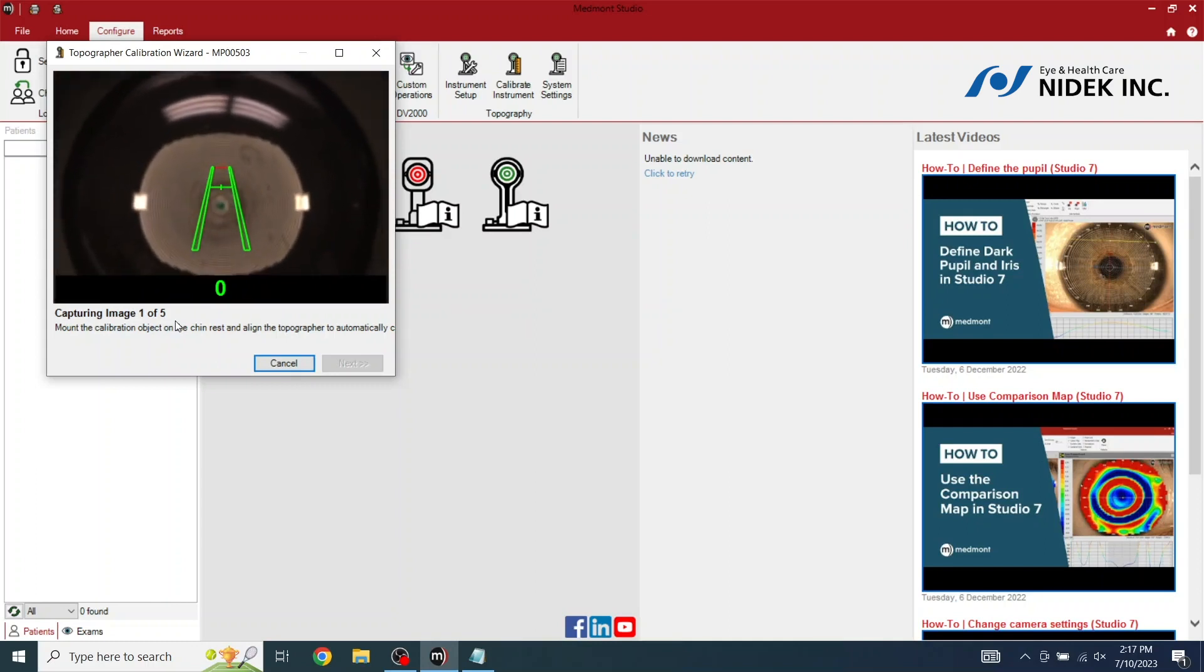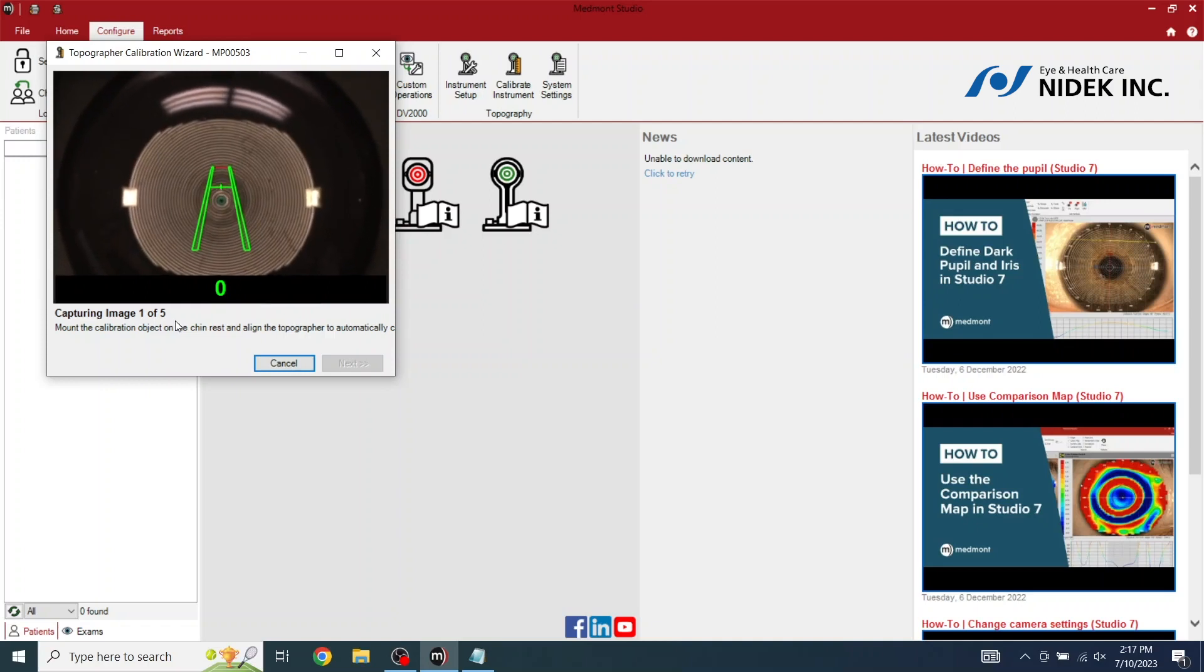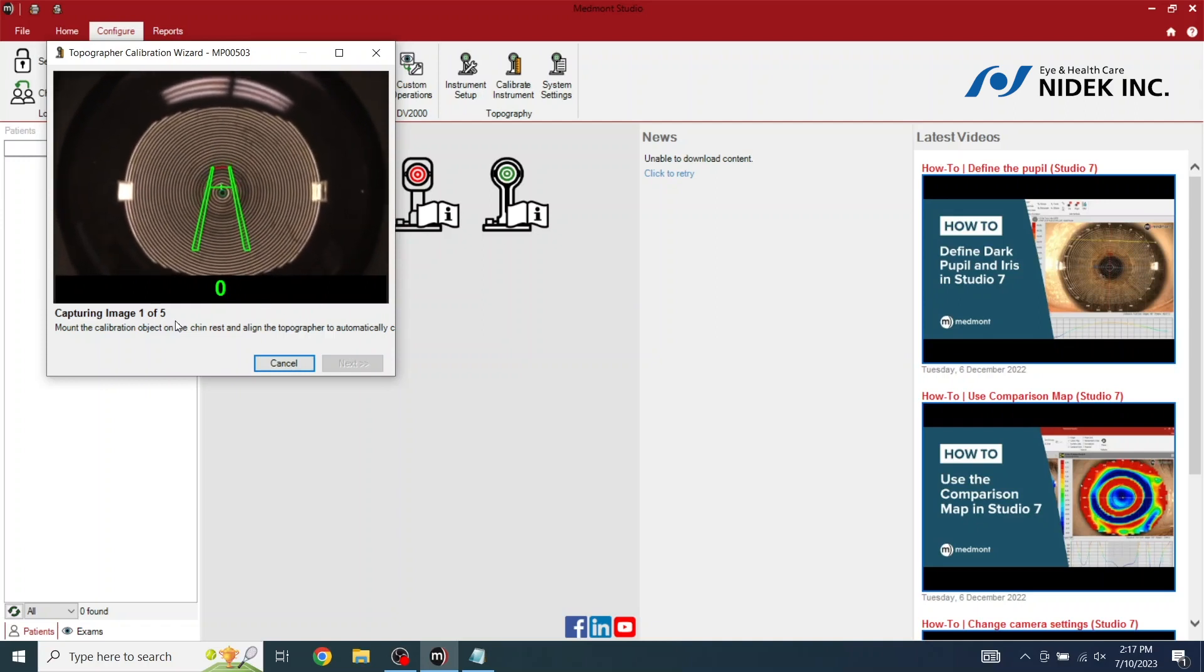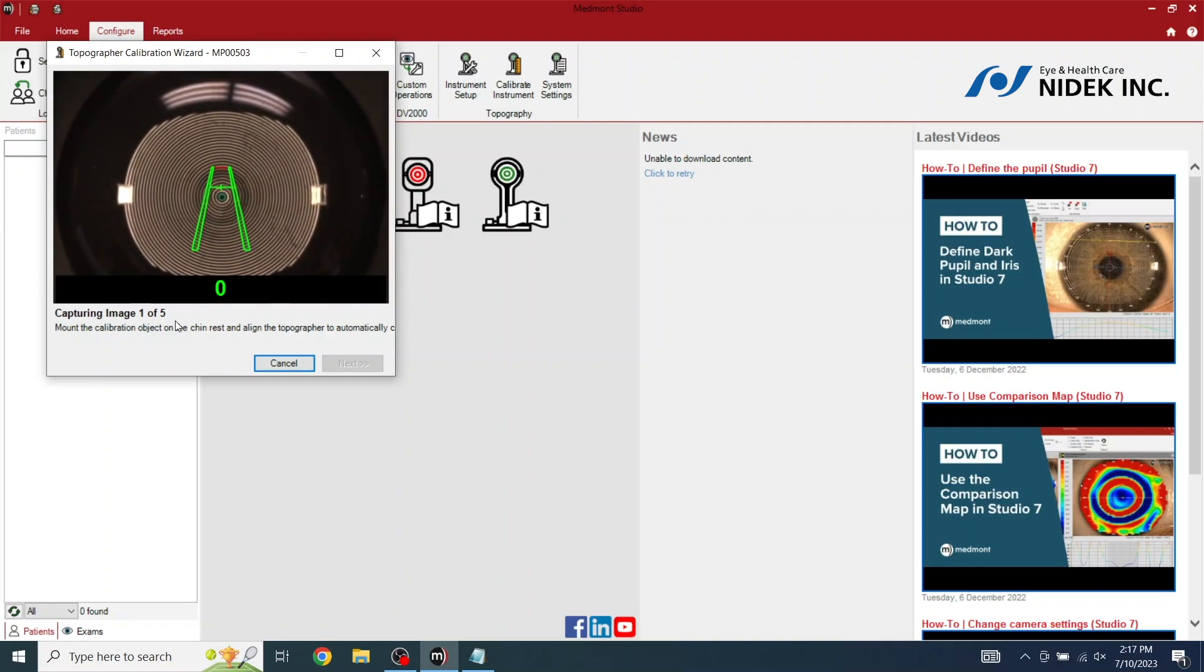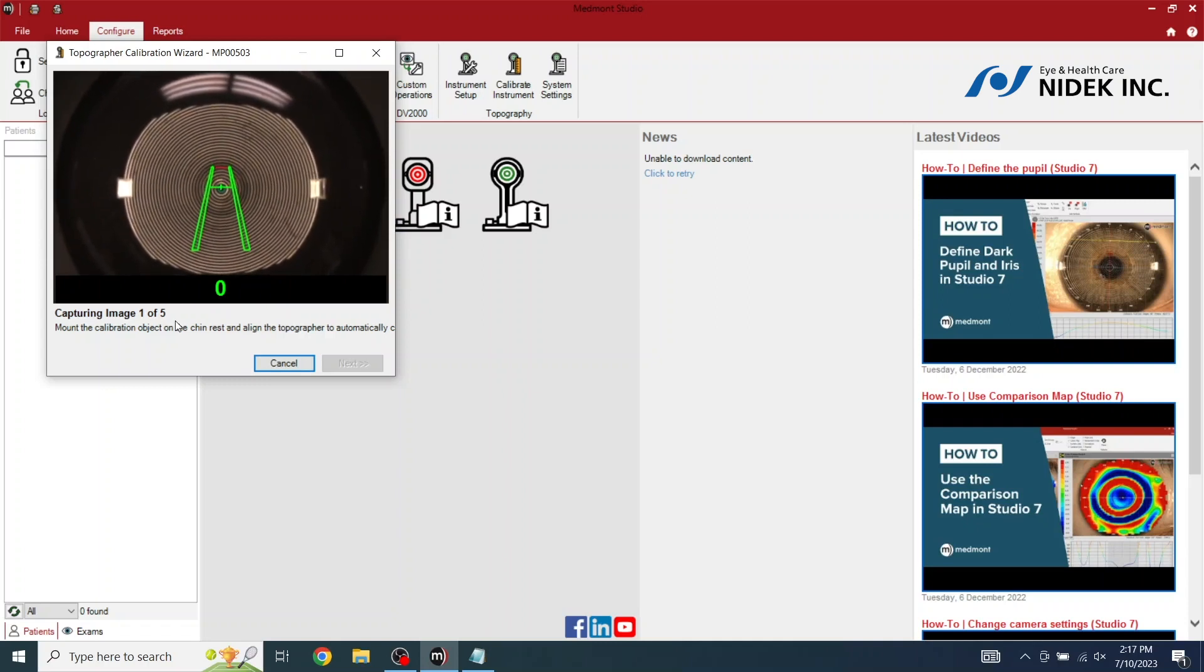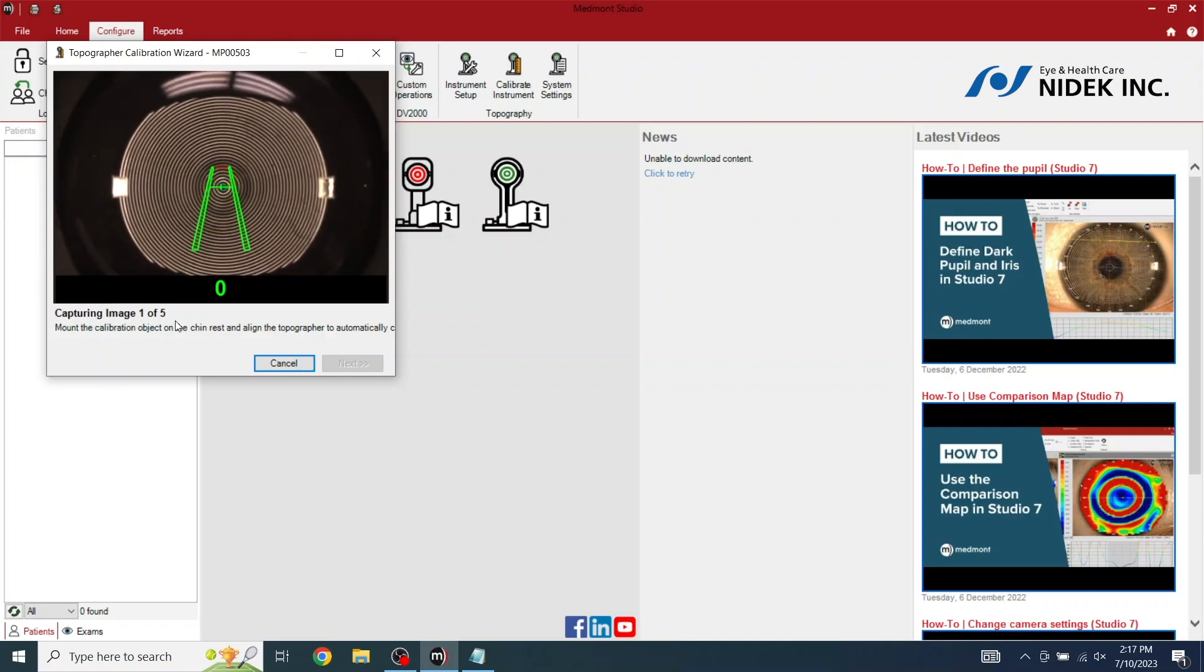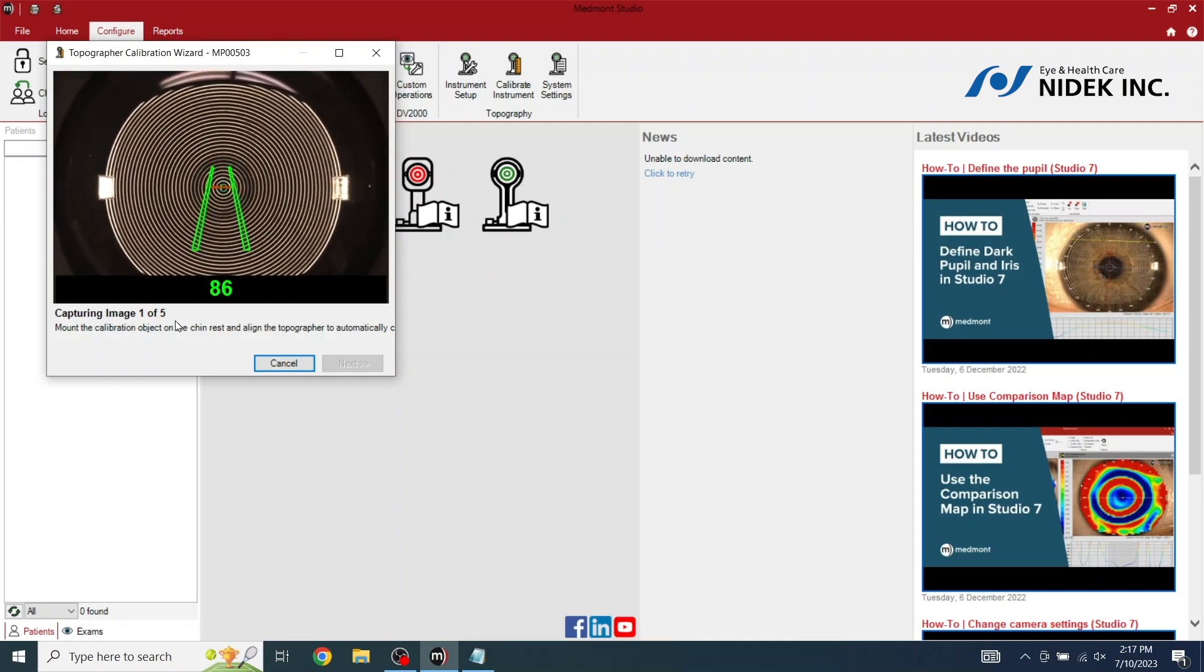As you can see here, the calibration ball has the reflection of the rings from the topographer. There's a runway. And there's a crosshair at the top of that runway, close to the top. That crosshair needs to be in the center of the eye or model eye to calibrate or to take examinations on patients. As you move this in, the red line must bisect the crosshair to capture automatically. Select next.